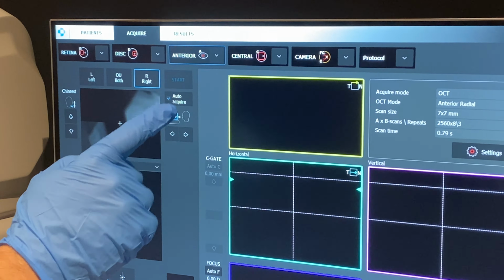So in this rendition window, there's some obvious tools, zoom in, zoom out. But if you're scrolling through a scan and you find some pathology, you can go to tools here. So these are the calipers. So if you had an edema or something, you could measure it in microns. You could then go to annotations. You may find something on the image, go to text and write something in so that it stays on. This is image 83 of 128.